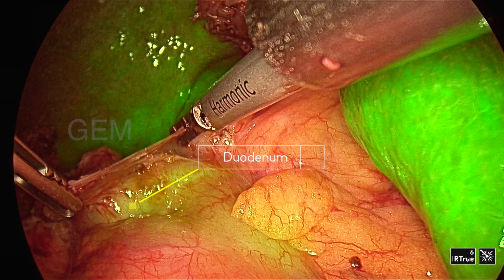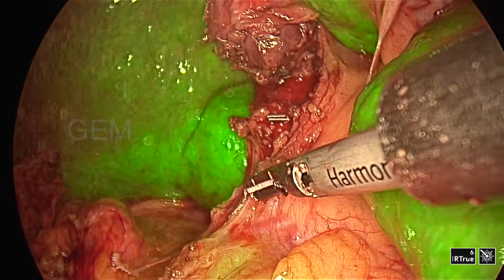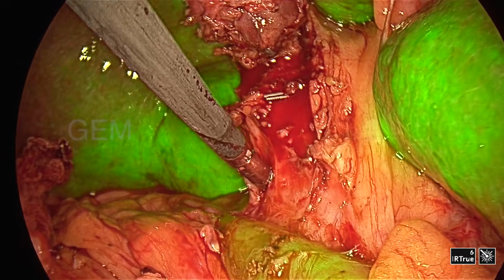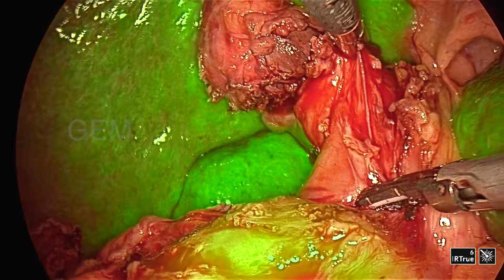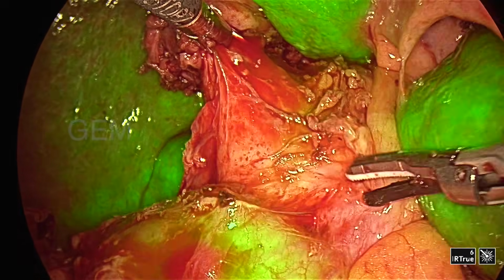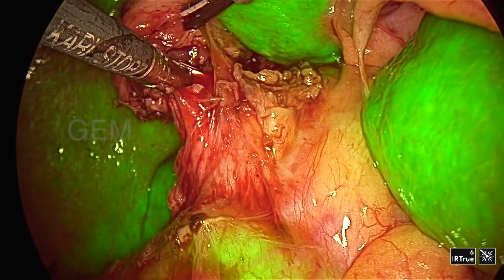So that is the duodenum. You can see the bile in the duodenum, seen in fluorescent green color. So that is the artery, the artery to the cystic duct. So I am retracting the duodenum down, mobilizing the duodenum and retracting down, and then I am going to the lower CBD. I could visualize it. Then I can go for the removal of the stone.